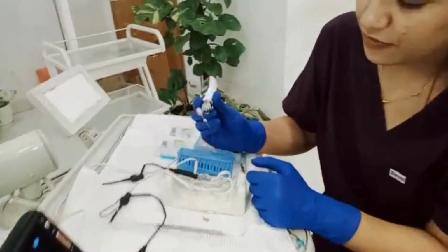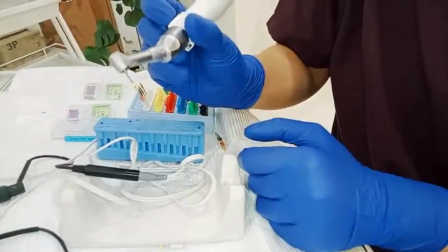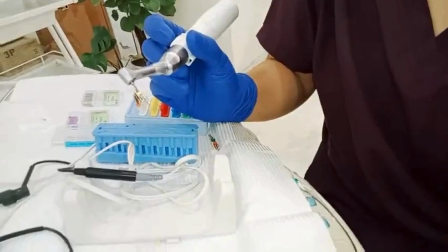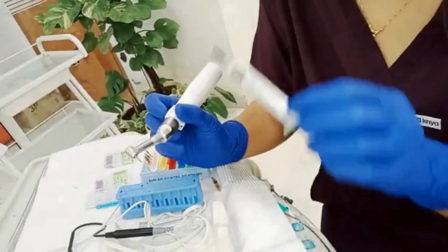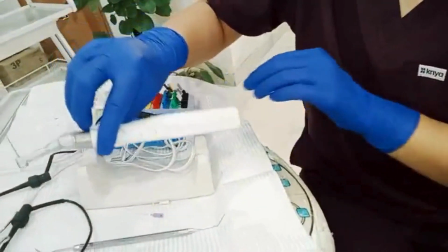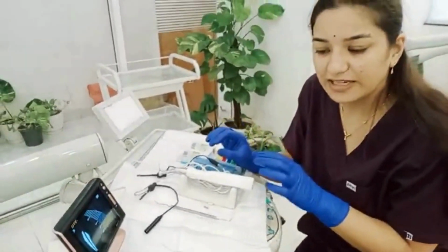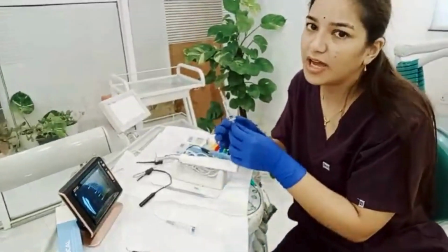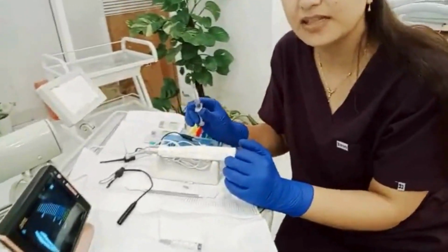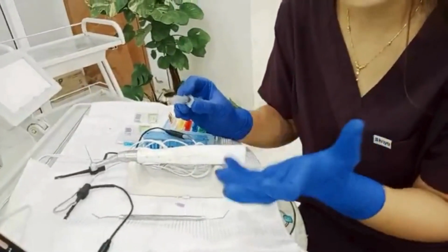So firstly we'll be using this file. Okay, if you want to use EDTA, you can use it. If you don't want to, you can also go with it. During all the procedure, while we are filing inside, we'll have to use hypochlorite and saline. Okay, so somewhere we can use only hypo, or you can use saline also.